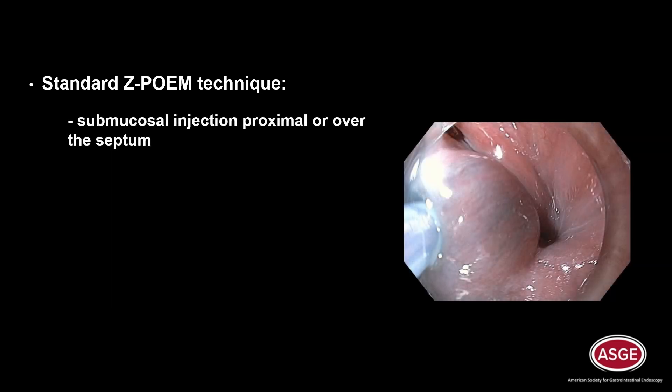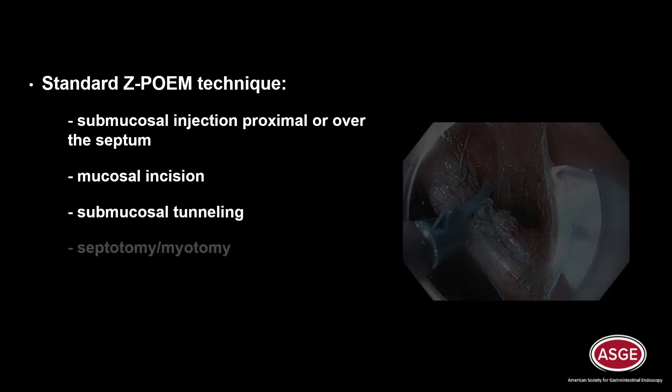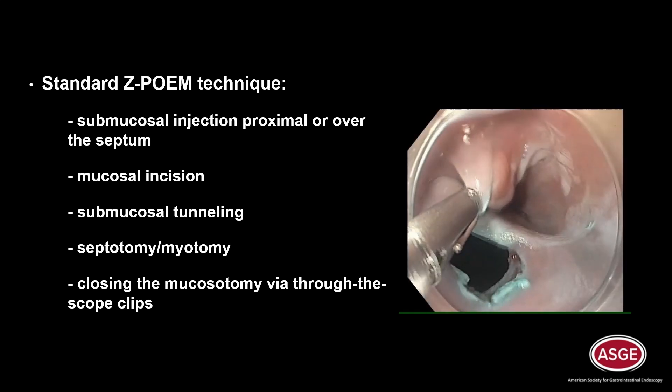Standard ZPOEM technique involves submucosal injection proximal or over the septum, mucosal incision, submucosal tunneling, septotomy or myotomy, and closing the mucosotomy with through-the-scope clips.